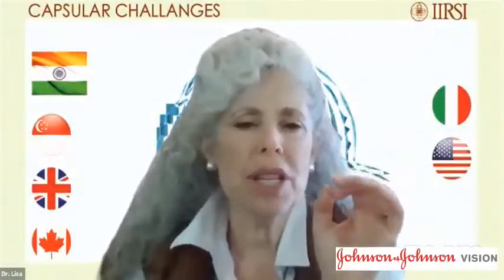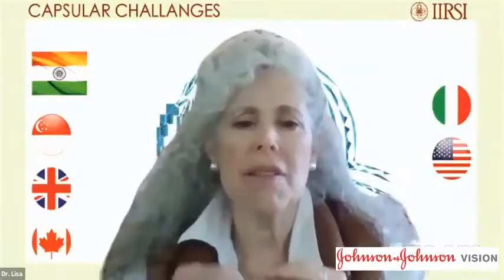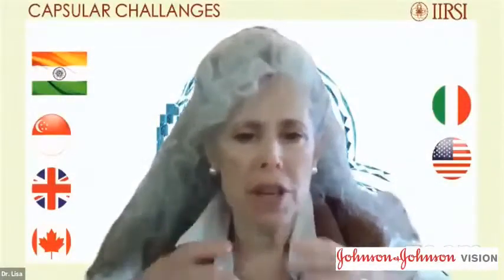Dr. Rohit, you wanted to say something? Lisa wants to say something. Sure, ma'am. Thank you. Just briefly, I think this is the one valid reason for using Healon 5 if you have that accessible, because the whole point is just to have the pressure in the chamber greater than the pressure in the lens. When you make a small opening and you have that nicely filled, you see a very slow egress of fluid, and it's another approach.